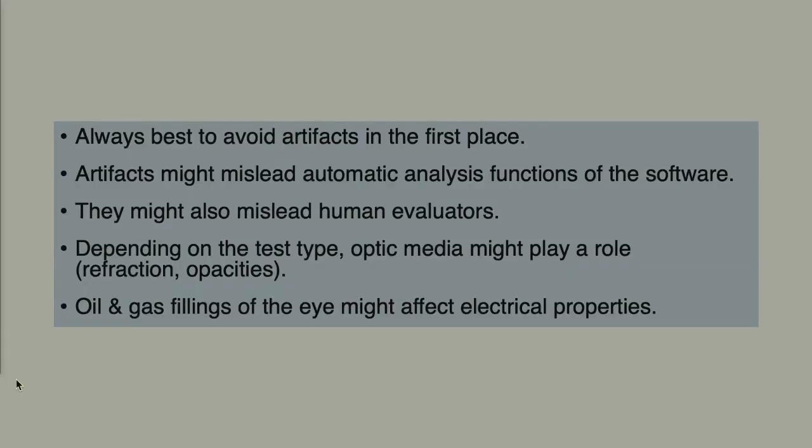And depending on the test type, optic media might play a role, like refractions and opacity. Opacities, we have heard a bit about that already in the preceding video presentation. And of course, for those tests that rely on pattern stimuli, refraction has some relevance. Opacities might play a role not only if no light is coming through, but for example in multifocal ERGs, where we want to have localized responses.